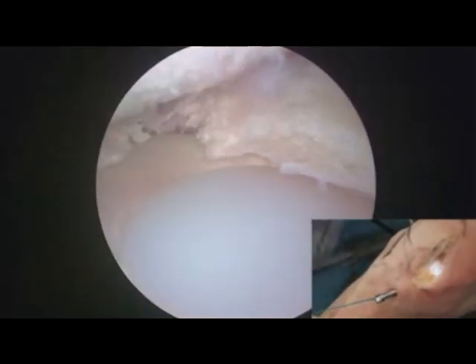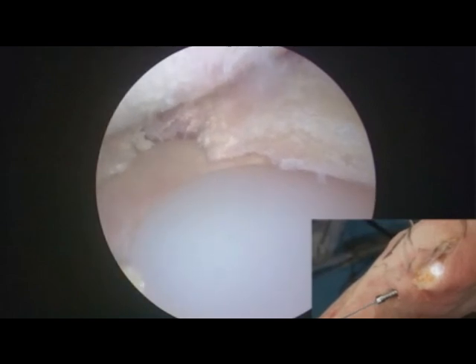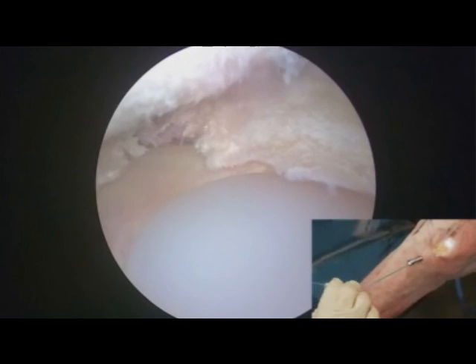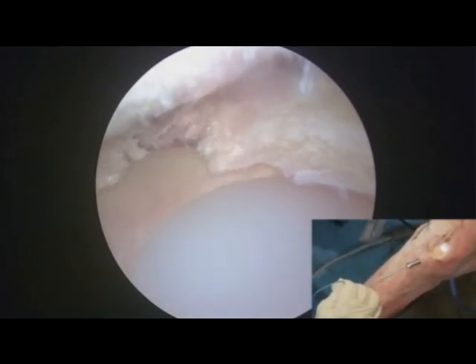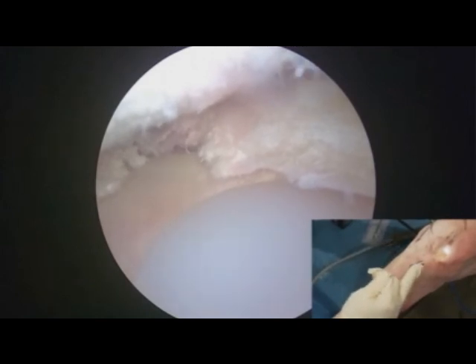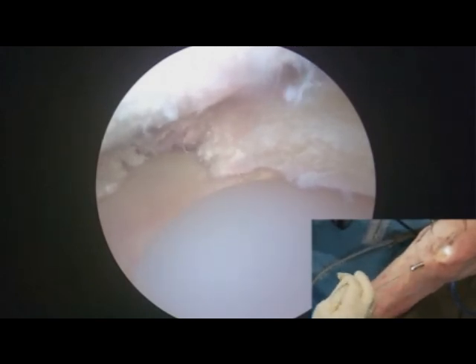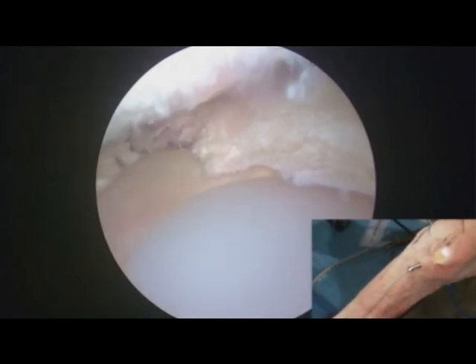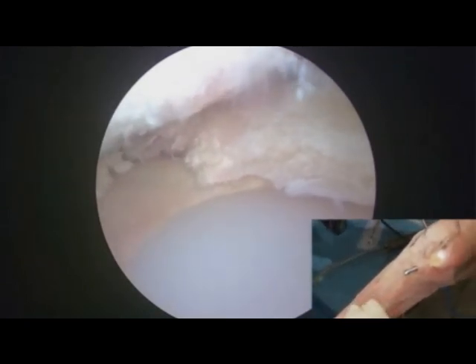Okay, and I'm pulling on that with the sutures. These sutures here are going to help me when I pressurize the cement at the end. What I use is the implant as a cap. We have a fixed hole here where we're going to put a plastic insert into the tibial hole. And what that allows us to do is pressurize the cement around the tibial implant. So at this point, we're done with our tibial implant except for fixation.